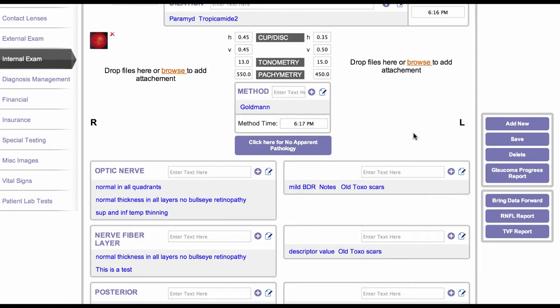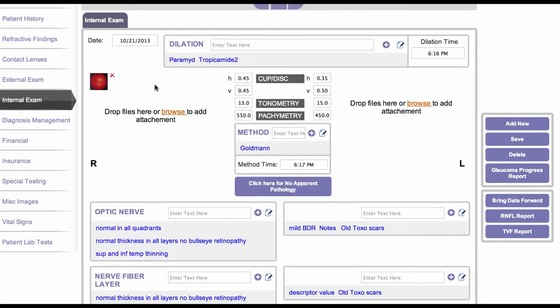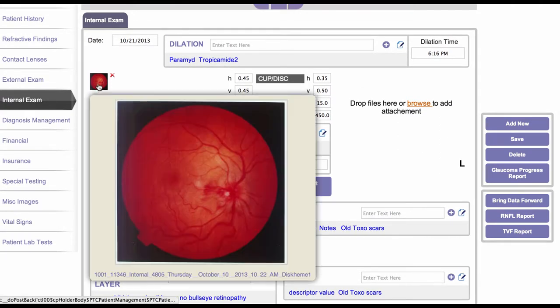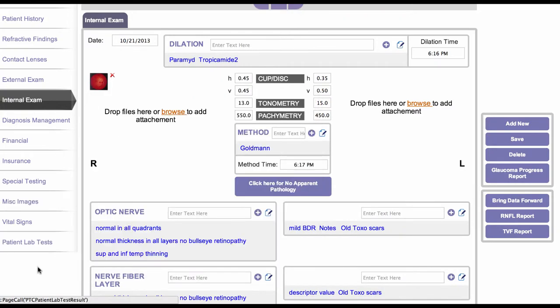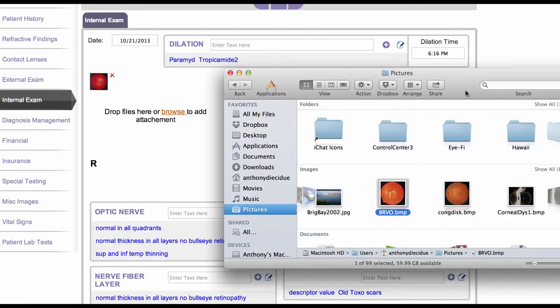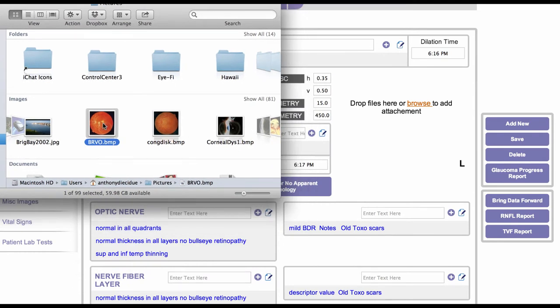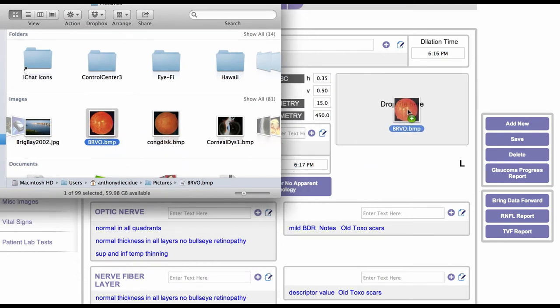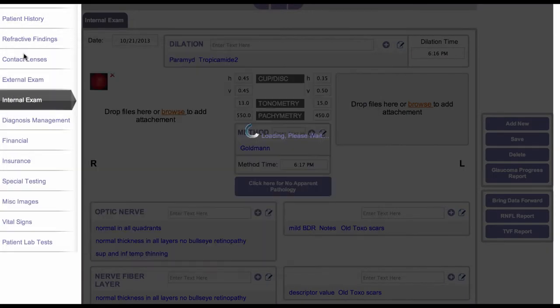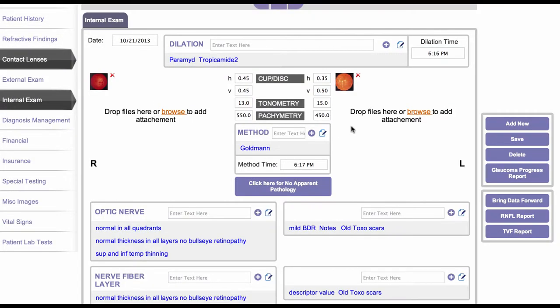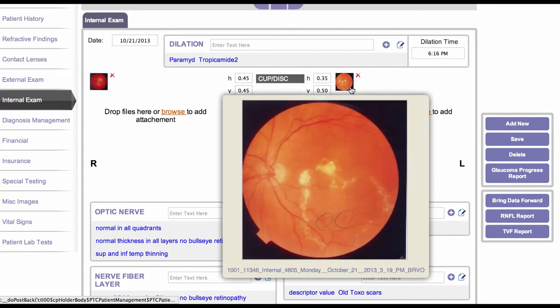Some interesting things about this page: you can see there is a picture here on the right of a fundus, and all you do is hover the mouse over it and that will bring up the picture for you to view. If you want to add a picture, like the other tabs, all you have to do is grab a picture, drop it, and that will add it to the patient's record. Then all you have to do is hover and it will pull up that picture for you to view.